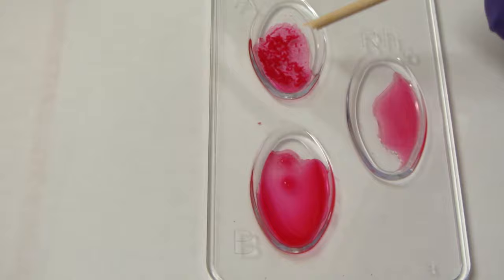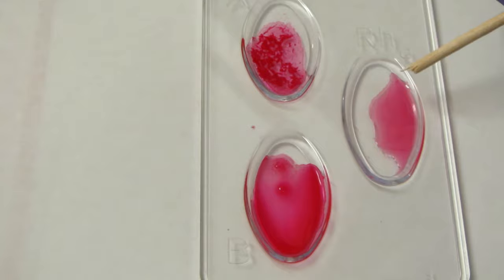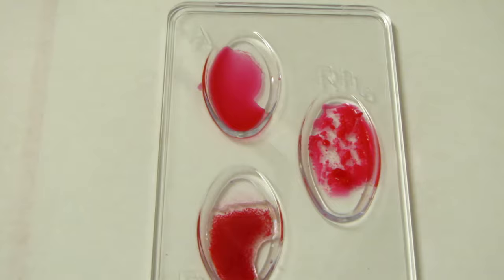Now compare that to this one, where we've got obvious clumping going on in the A well again, nothing going on in the B well, and nothing going on in the RH well. So this one in contrast is A negative. Remember: if your RH is present it's positive, if it's not, it's negative.